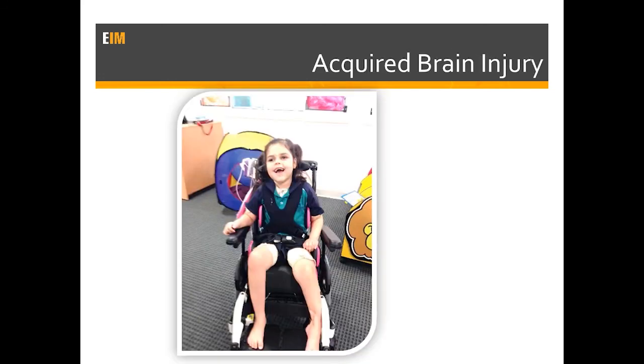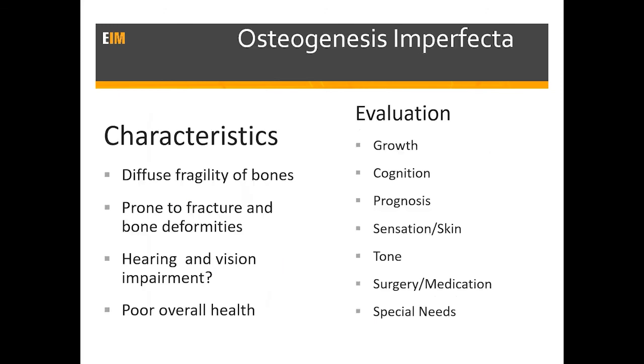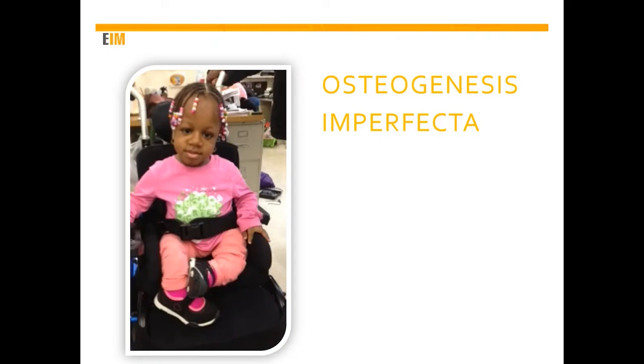Also, in terms of a power wheelchair, you want to make sure that if you anticipate them driving, they'll need to have access to that joystick in a functional and a safe location. Let me go back one picture. Her joystick is a little bit out of the picture here, but very close, and it's also on a swing-in mount so that when she's driving, it can be right at her belly. It's very, very easy for her to access.